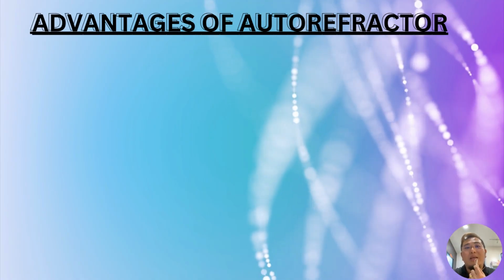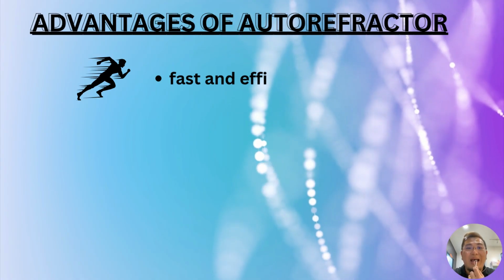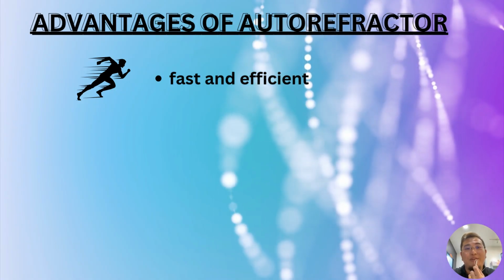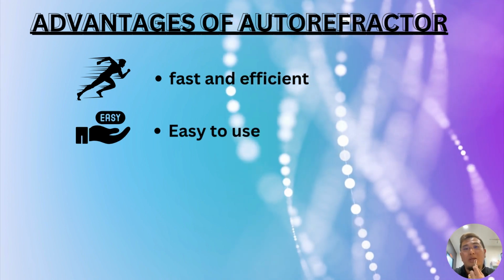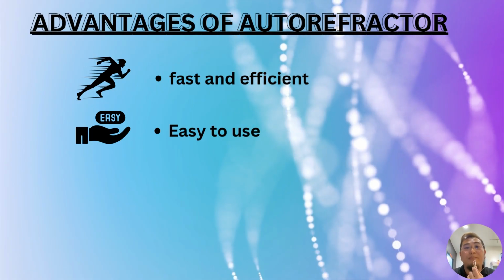Number 1. It is fast and efficient. It can measure the refractive error of each eye in just a few seconds, making it ideal for busy clinics and vision screening programs. Secondly, it's easy to use. The procedure is simple and requires minimal cooperation from the patient.